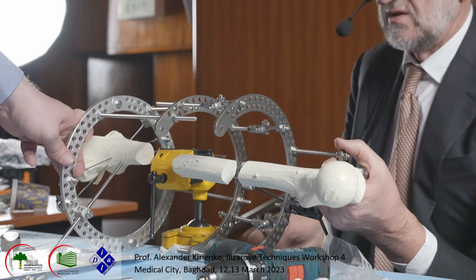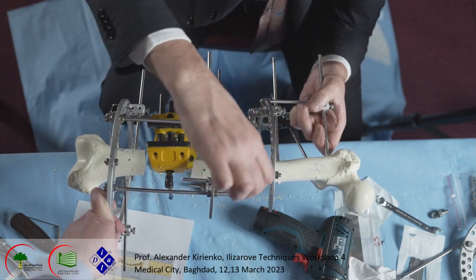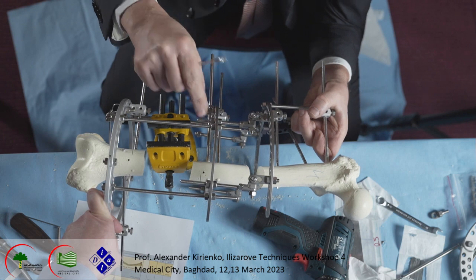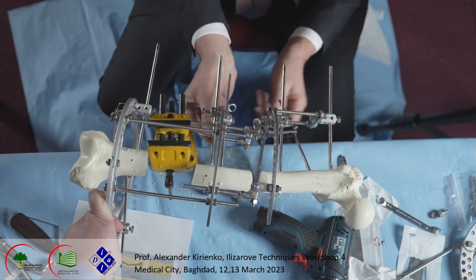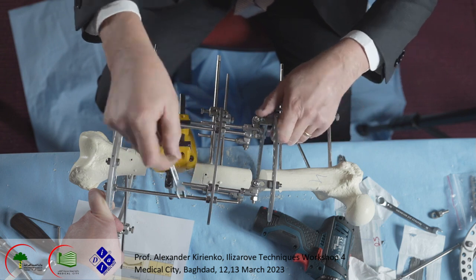In the same system, you may use it for correction of procurvatum or recurvatum, because when we do lengthening, another complication may occur, a procurvatum deformity.